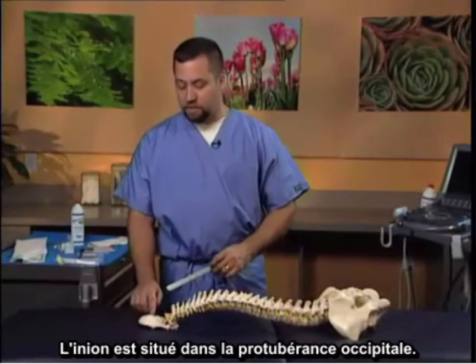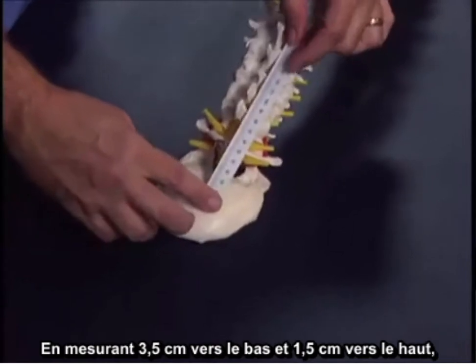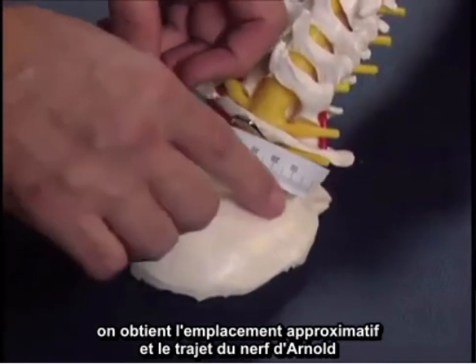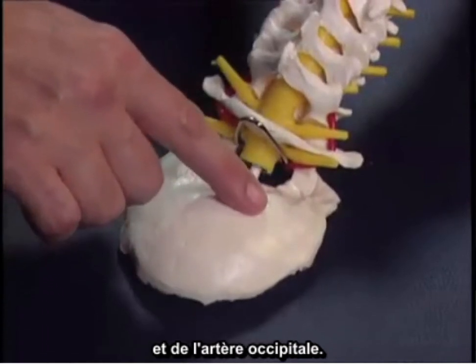The inion is located — the occipital protuberance. The measurement is made three and a half centimeters down and one and one half centimeters over. This is the approximate location and the tracking of the greater occipital nerve and the artery with it.